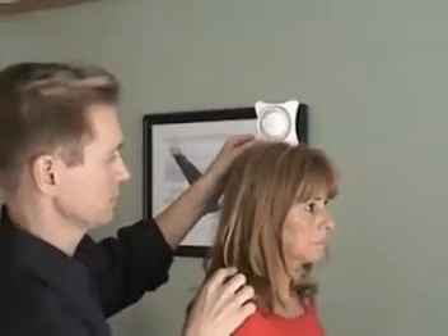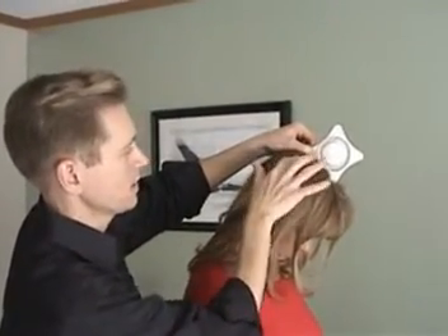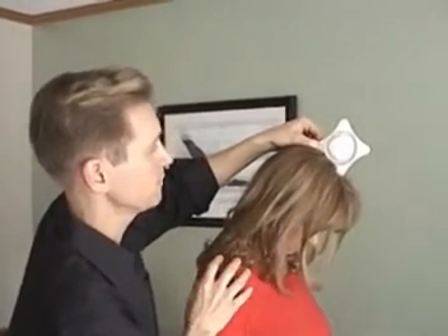When the person goes into flexion, as their head moves forward, it's very important to just keep your hand in contact with the head and then you can read the number. In this case, Marsha is moving forward at 50 degrees.